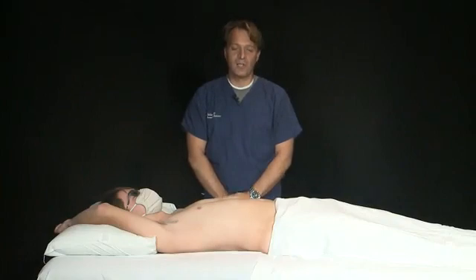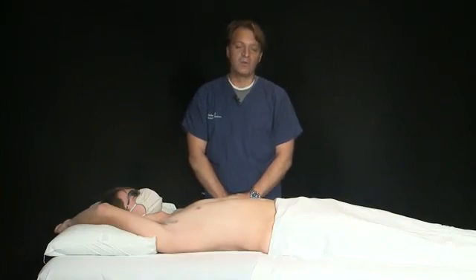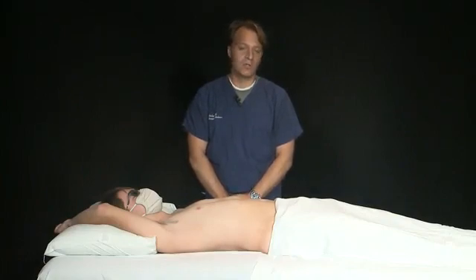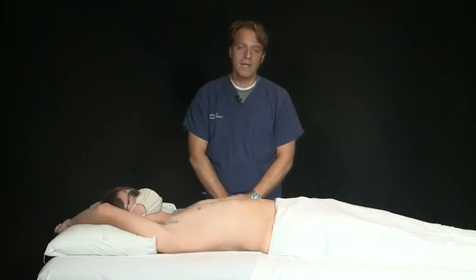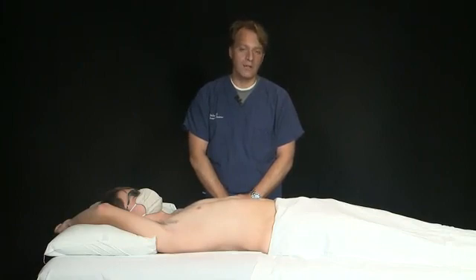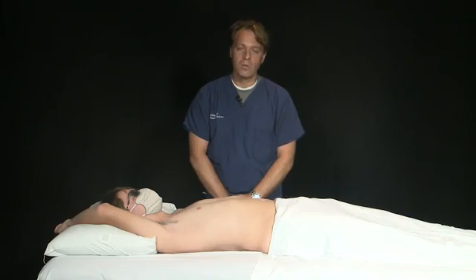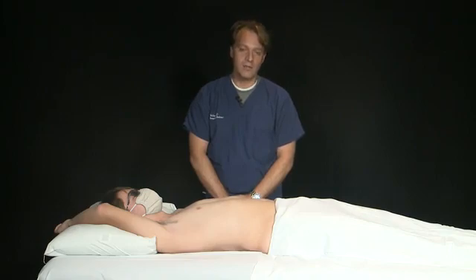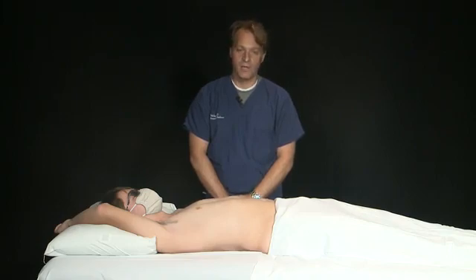The third lung ultrasound imaging protocol is one we traditionally use when we're concerned that a patient may have pneumonia. Also known as the Lichtenstein protocol, we're going to image the anterior chest, the lateral chest, and then the posterior chest.